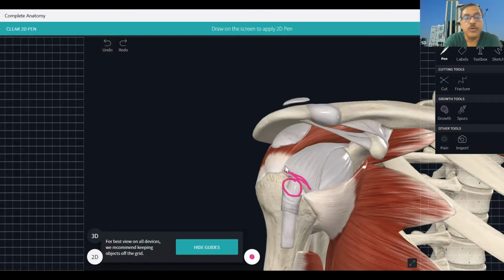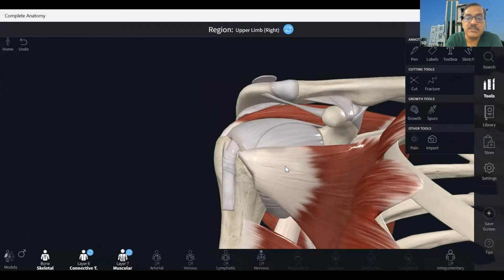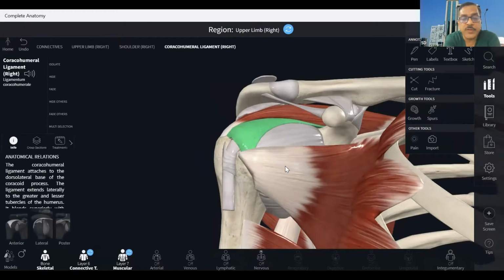And we also will be mentioning there, as I was mentioning, that thickness of the coracohumeral ligament. So this was the coracohumeral ligament. So this coracohumeral ligament thickness, that can be also one of the aspects of diagnosing the frozen shoulder or adhesive capsulitis. But again, it's not very sensitive. There might be some misleading reports. But still, classically, many people use that, measuring the thickness of that.